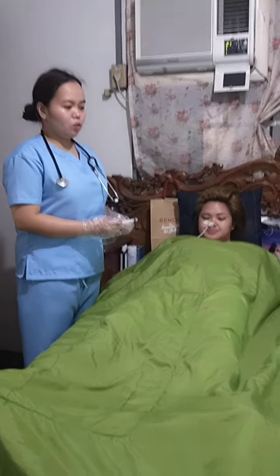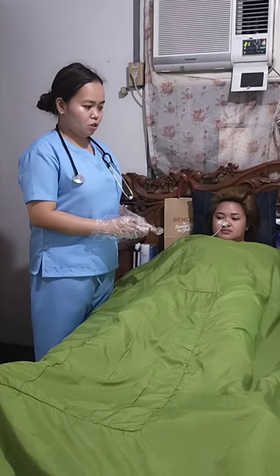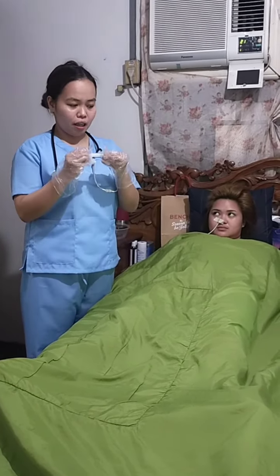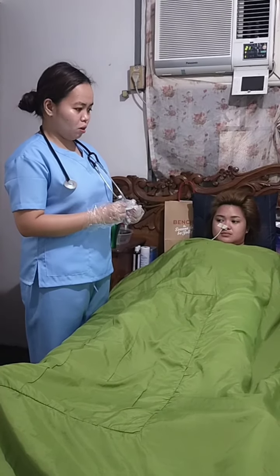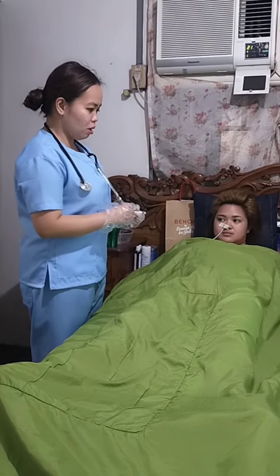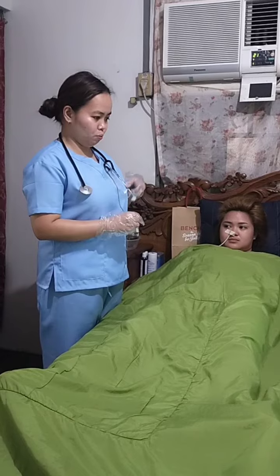Attach a syringe to the end of the tubing and aspirate a small amount of stomach contents. Visualize the aspirated contents, their color and consistency. For auscultation, inject a small amount of air, 10 to 15 ml, into the nasogastric tube.